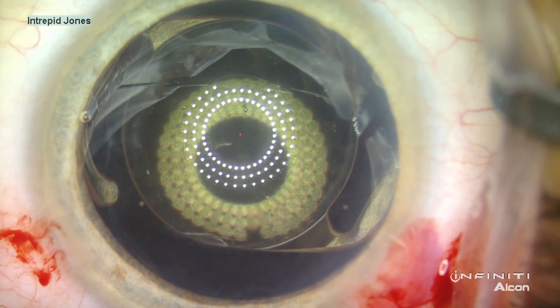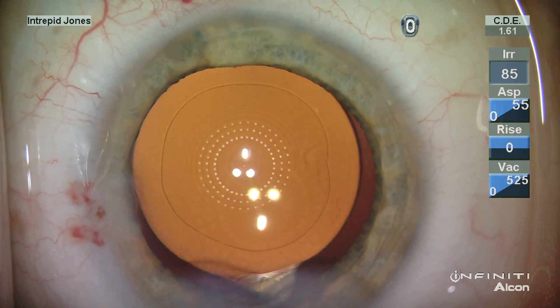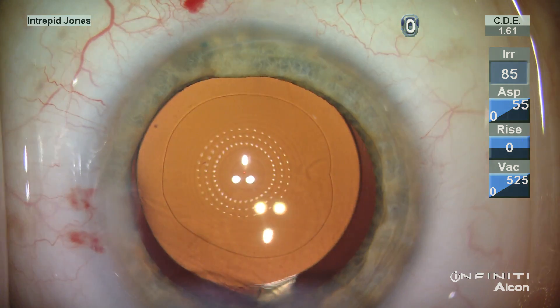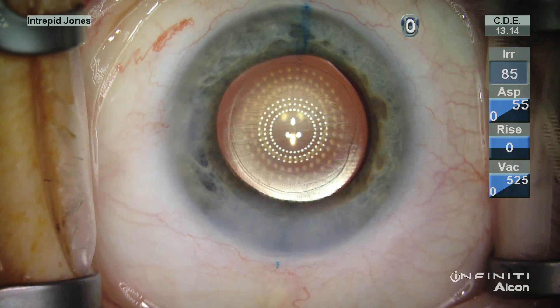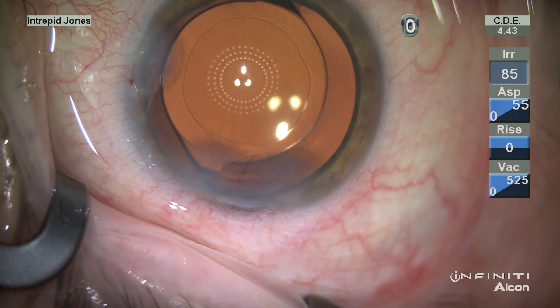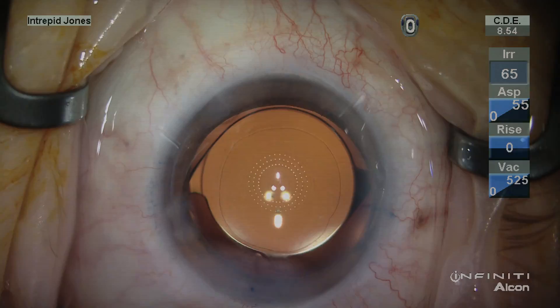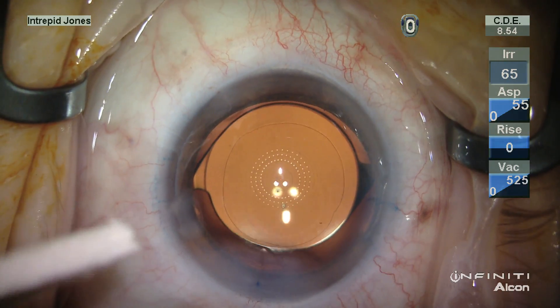Beautiful centration there — right on target. With this illuminated surgical keratoscope, I no longer have to estimate where the visual axis is — I now know. I also have a guide for treatment of astigmatism intraoperatively. I find this to be the quintessential and essential tool for the modern refractive cataract surgeon. Thank you.